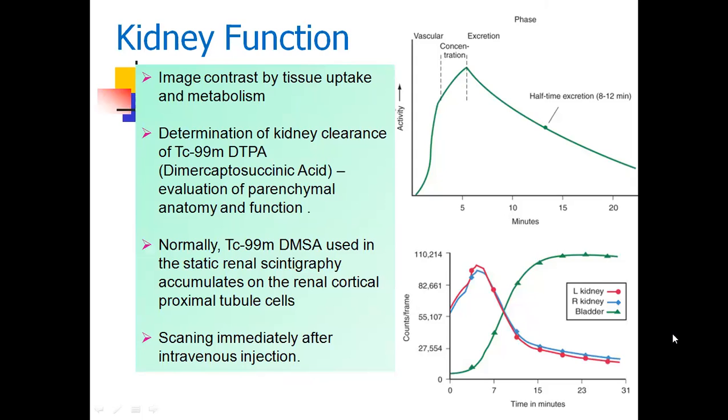Kidney function may be evaluated during a nuclear medicine procedure called nephroscintigraphy. Its image contrasts by tissue uptake and metabolism.